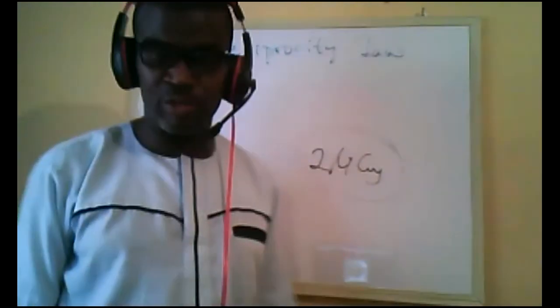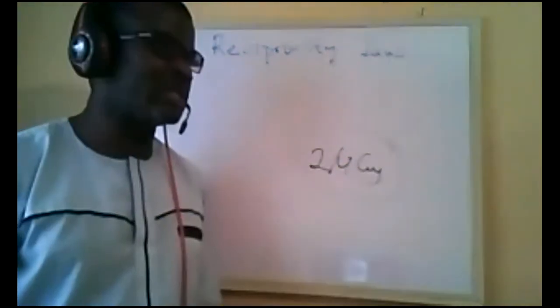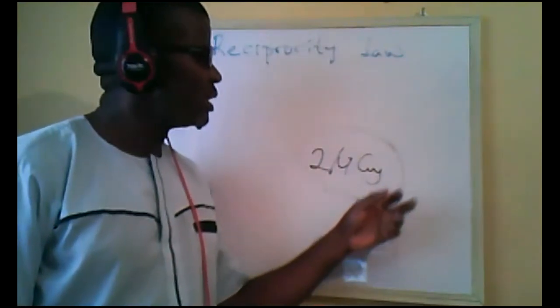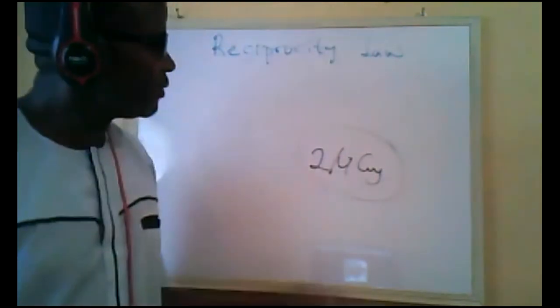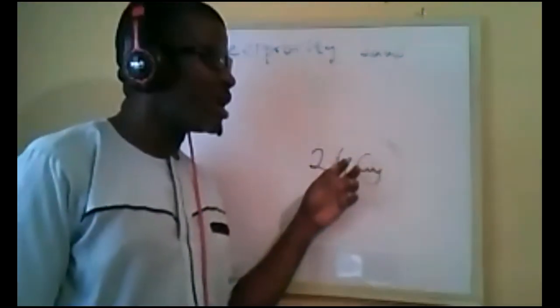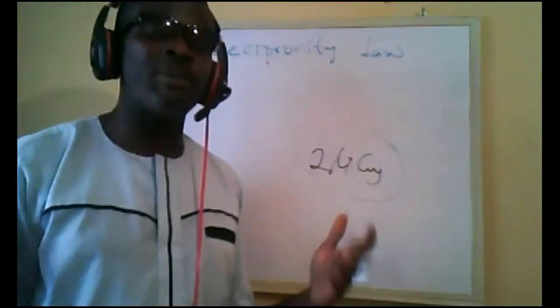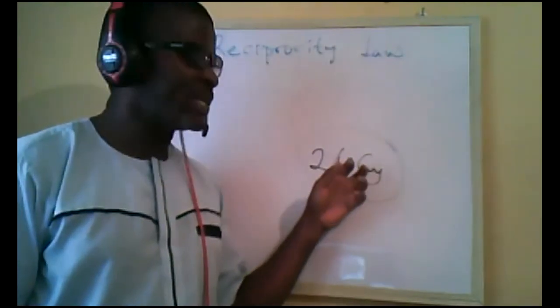Let's say exposure. Exposure is measured in milliroentgen, but let's just assume this is exposure. This is dose anyway. So for this exposure, we should have the same optical density, no matter the rate at which we get this.